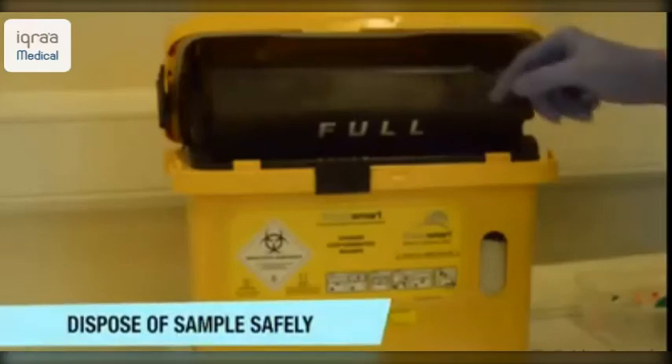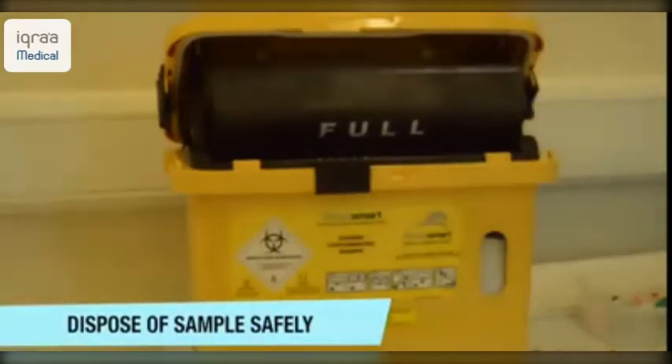Again, ensure that you dispose of your sample safely at the end of this procedure.